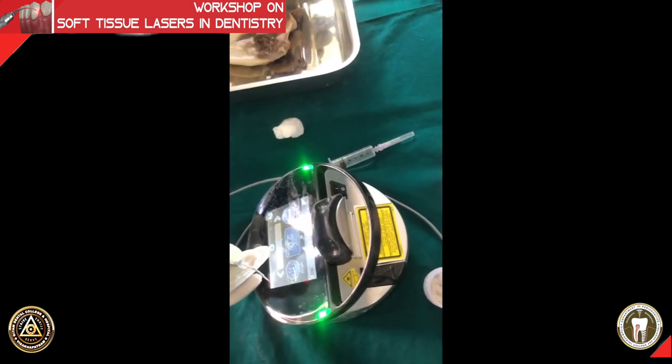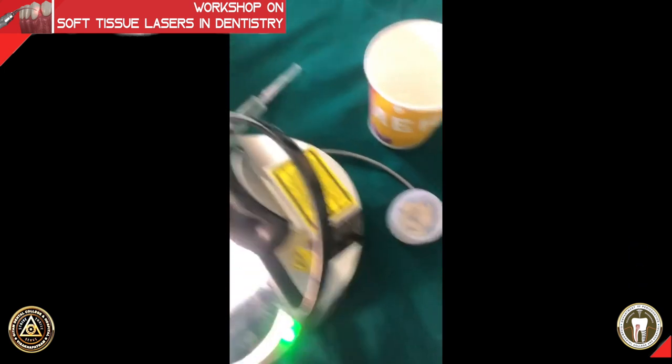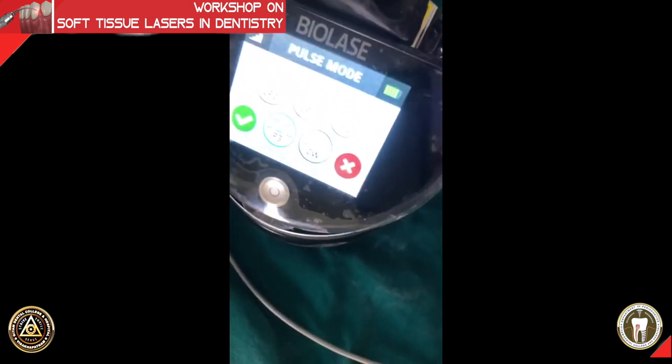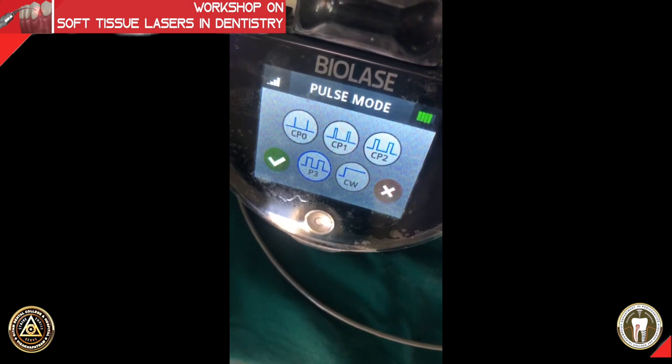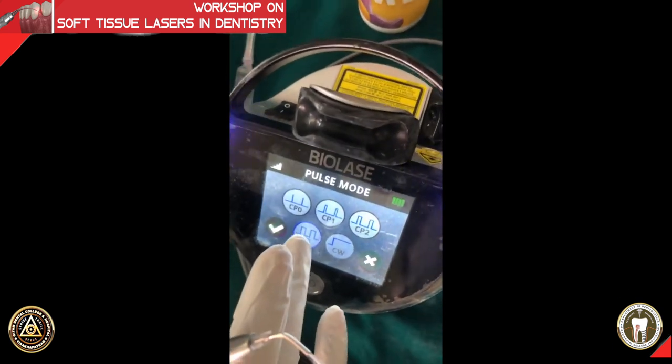That completes our gingivectomy procedure. The final thing is a de-epithelization, which sir is going to show on the mandible — we are going to see how it looks on meat instead of on a tomato.